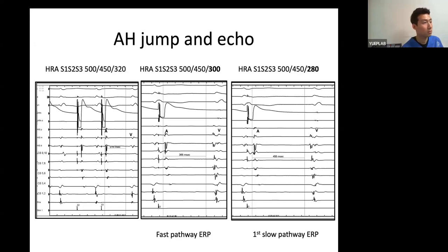Again, AVNRT ablation is potential guided, based on knowledge of anatomy and evaluation of that particular patient's variation. There's no same patient, no same AVNRT. Every patient is different. The CS is different, the location is different, the EGM is going to be different. So you just have to map it, learn, figure out where it is, and ablate. I have not seen a single heart the same in anybody in the world yet. So keep that in mind. Learn the heart first before you play with it. You get used to the catheter motion and all that, then you can start to ablate. Not before.